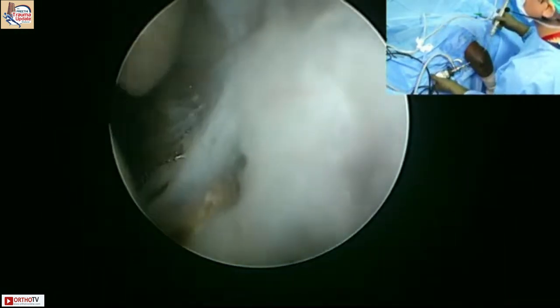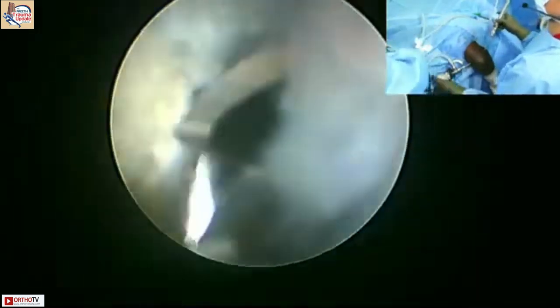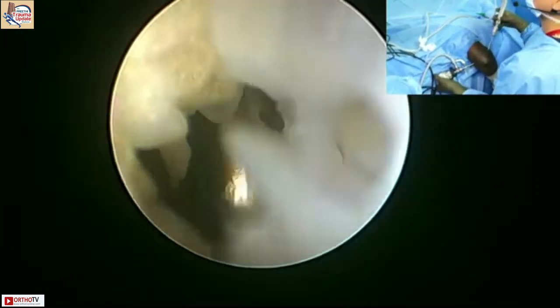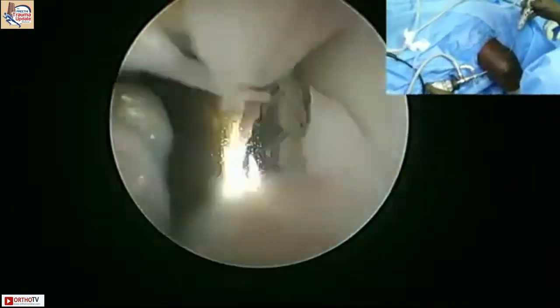Straighten the elbow. But I think doing a stiff elbow is more challenging. It is. The less the space, the more the problem. Yes, the tennis elbow release will be ideal, and even if you want to open it on the lateral side, you can get away with it being a keyhole, so a big incision won't be needed. True.